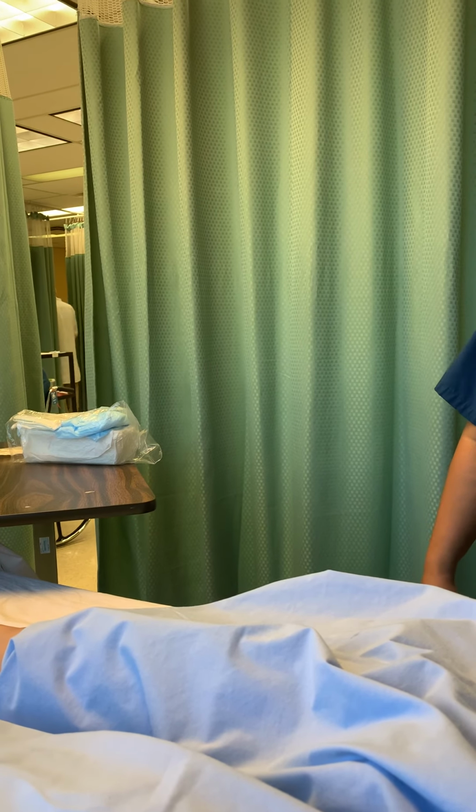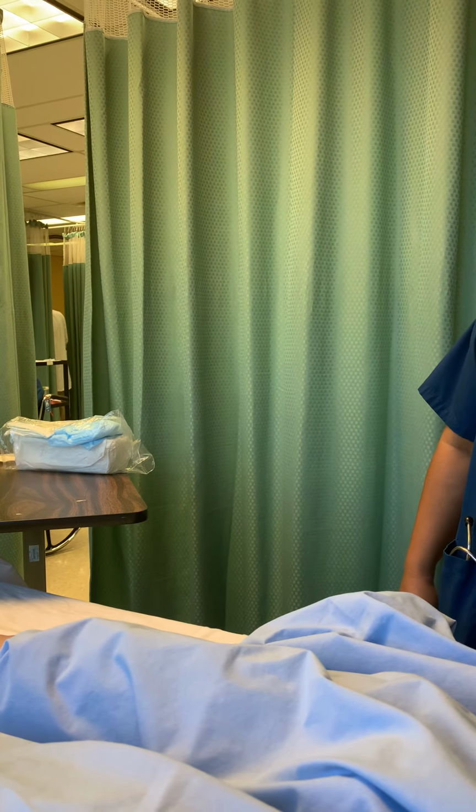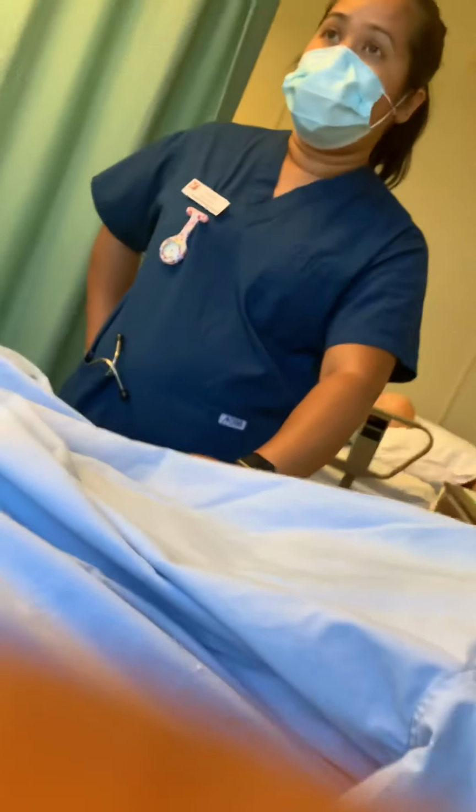Mr. David, can I check your ID band, please? And you have to make sure to always check the ID band, especially in a nursing home. They have lots of name alerts, same first name and last name, so it's too dangerous, right? So that's the most important thing.